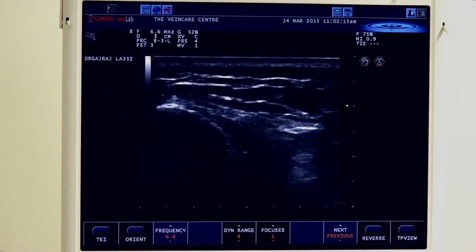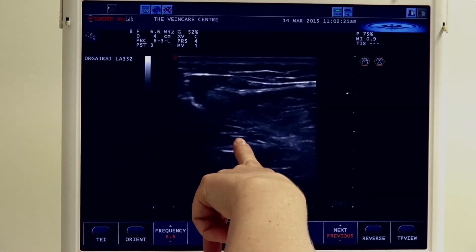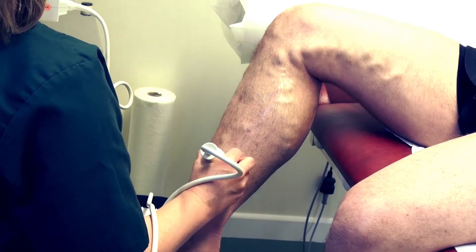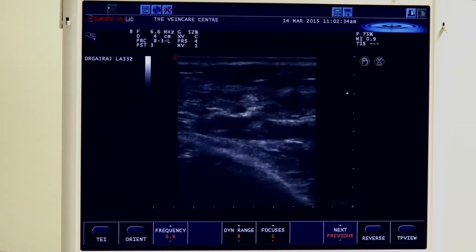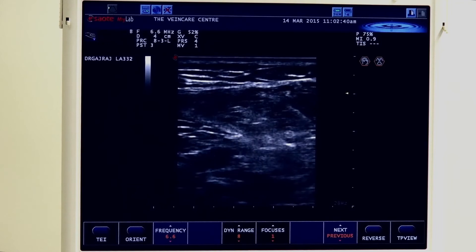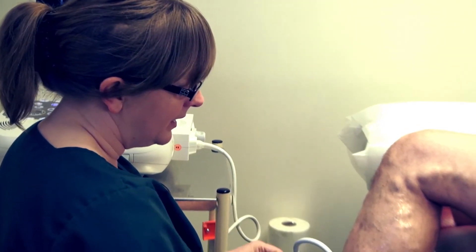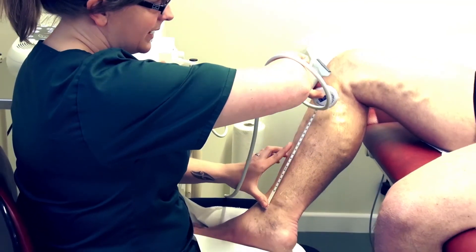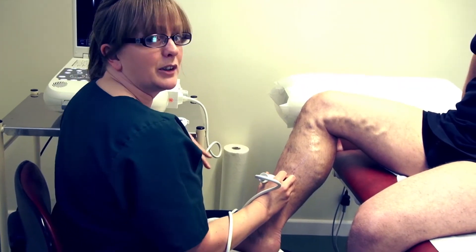As a guide to checking the calf perforators: if we keep the tibia in view we can assess for any paratibial perforators, and coming more medial this will pick up any Cockett perforators coming in on the medial calf. A good way to indicate to the surgeon the level of the perforator is to place a ruler on the medial malleolus and measure to the level of the perforator, telling them exactly what level they're going to find it — in most cases it isn't visible on top of the skin.